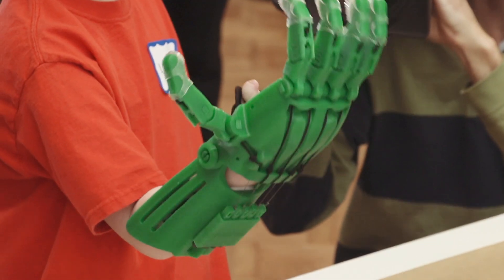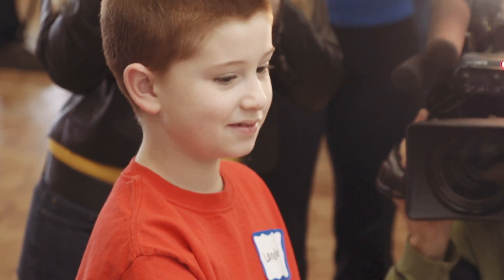Actually working with patients and seeing them try out their hand for the first time, seeing the sparkle in their eyes as they're moving it — that's just, this reaffirms I'm doing the right thing here.